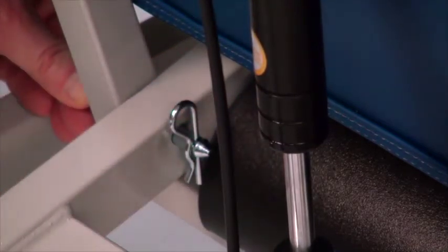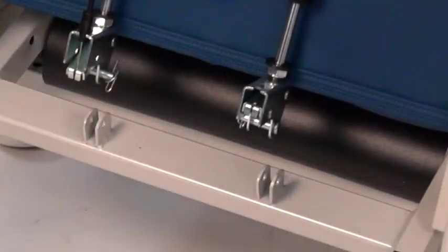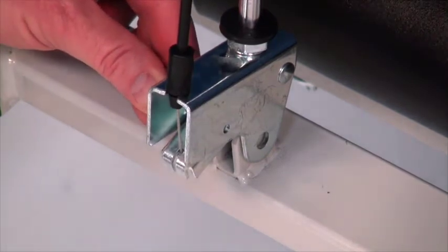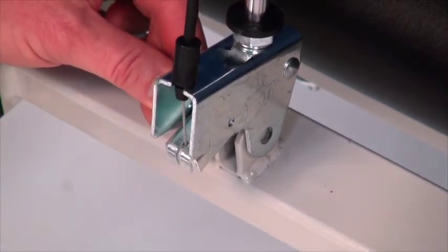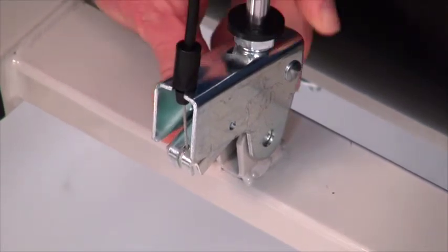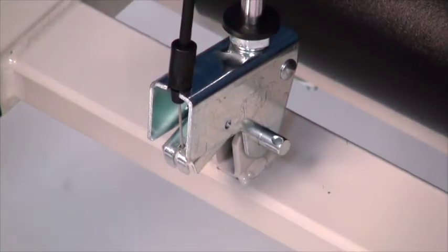With assistance, raise the upholstered back to the vertical position. Tuck the plastic skirt at the rear of the back behind the seat frame cross brace. Align the hinge at the bottom of the gas spring with the holes in the U-brackets on the seat frame cross brace. While holding the back in position, secure the gas spring hinges to the U-brackets by placing the 5/16th of an inch diameter clevis pins through the U-brackets and gas spring hinge.